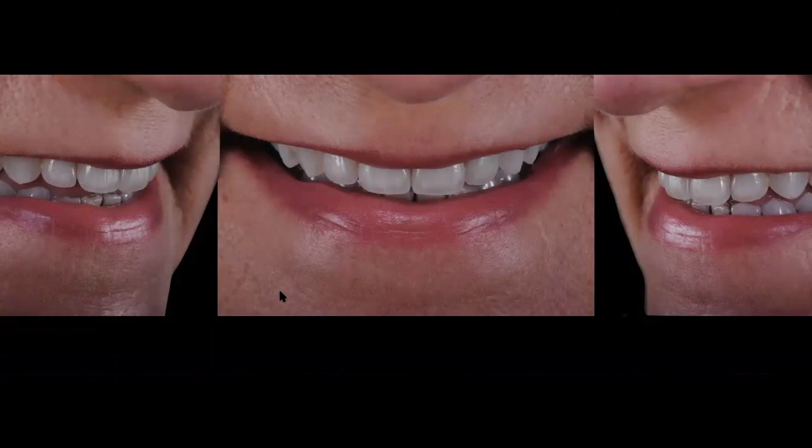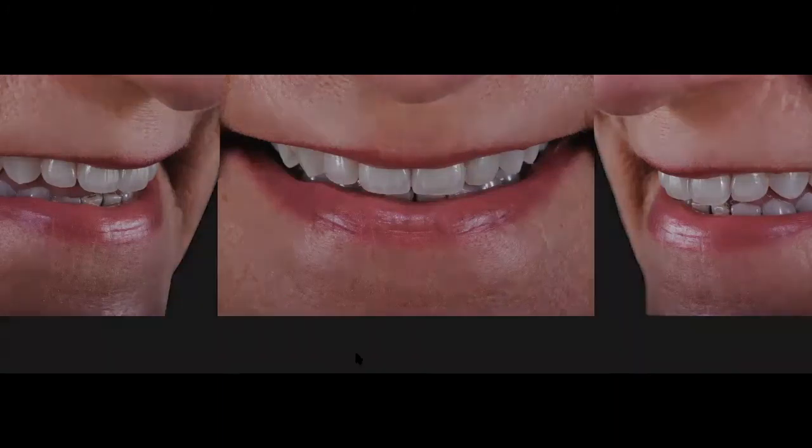I did not want to go back to the canines. The canines were virgin teeth, they were intact. Nobody's going to give this patient better enamel than what she naturally had on the canines. So who am I to remove that enamel? I'm nobody to remove that enamel. I'm someone that can give her some enamel on the teeth, or replace that enamel on the teeth that had the issues. And in this particular case, were the centrals and the laterals.